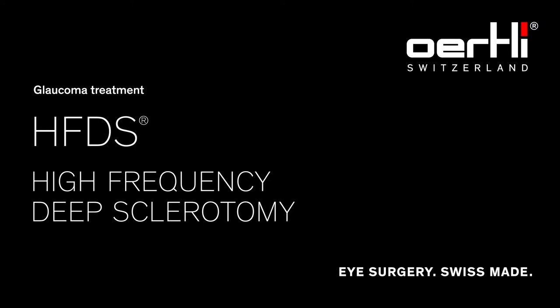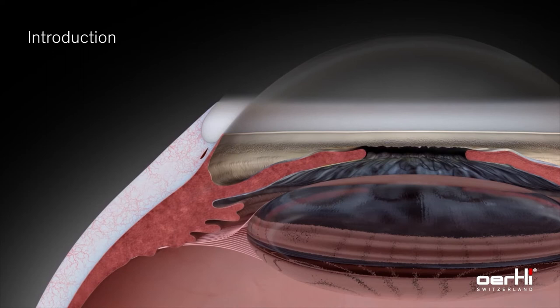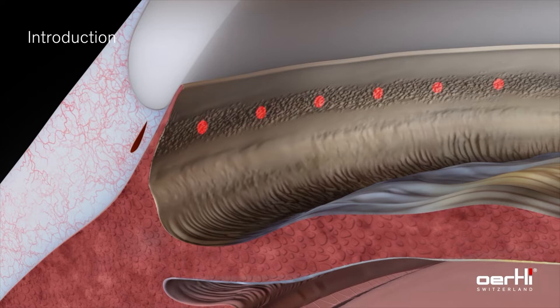HFDS — High Frequency Deep Sclerotomy. The High Frequency Deep Sclerotomy, or HFDS, is an implant-free ab interno minimally invasive procedure to lower intraocular pressure in mild to moderate open-angle glaucoma by reducing the outflow resistance of aqueous humor.